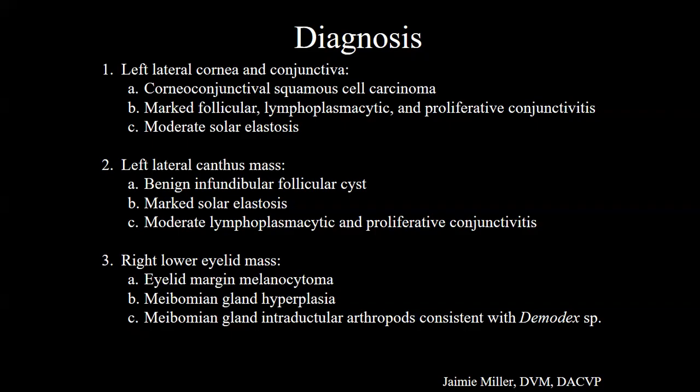How often do you see the melanocytic associated with glands? Because as soon as you show that, it's just going to be a pigmented meibomian gland. Yeah, that's really unusual proliferation, so that caught me off guard. Yeah, I'm not sure I've ever seen one.